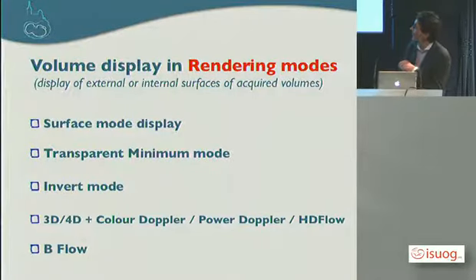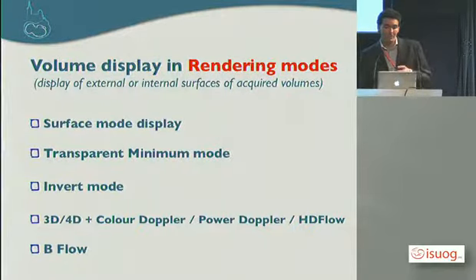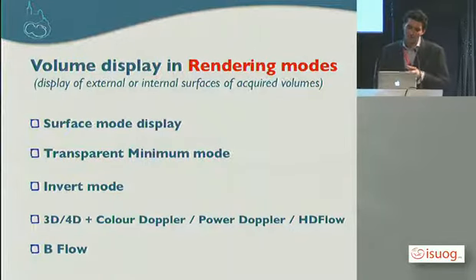There are different algorithms: surface mode display, transparent minimum mode, invert mode. You can combine all these modes with color, power Doppler, HD flow, B-flow, and I will try to show you in which situations they can be considered an additional tool.